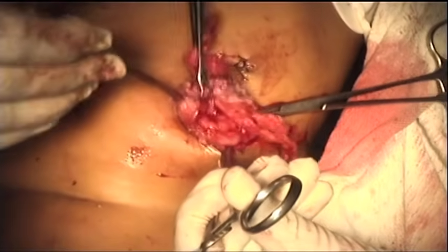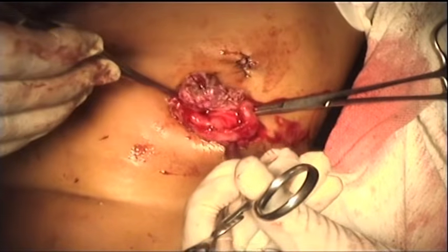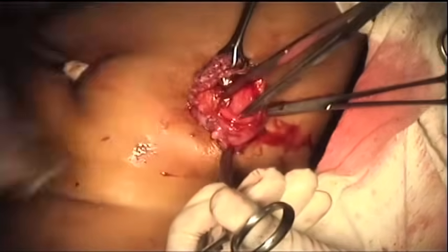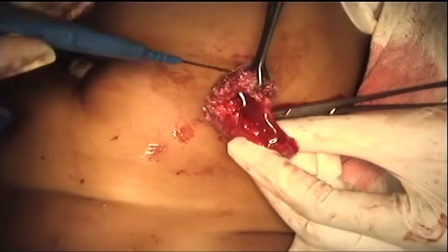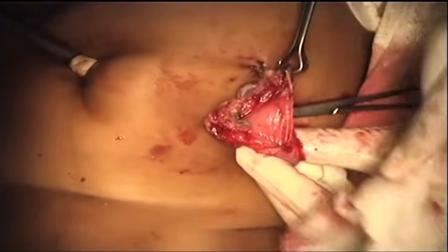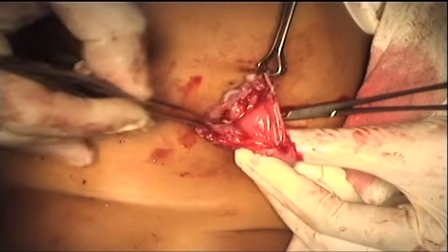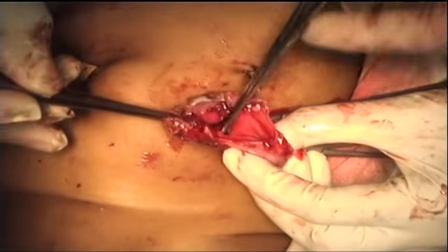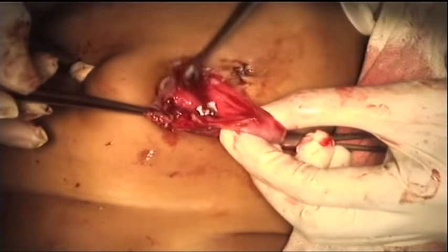So we orientate the colostomy correctly, excise the part of the margin which has skin attached from the previous site, and then use the seromuscular and the mucocutaneous sutures to form the colostomy.